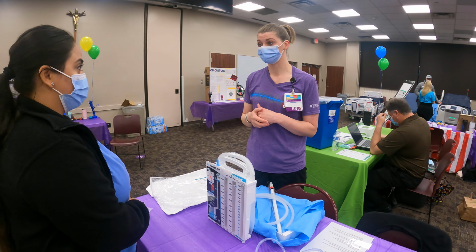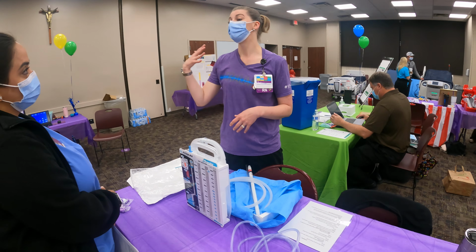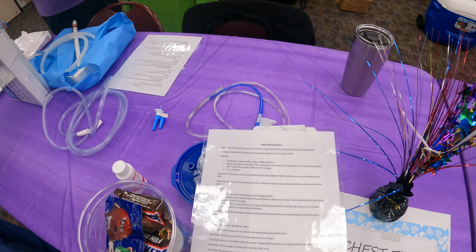It's 48 to 72. Yep. So you want to write your initials, your date and your time. You want to educate your patient. This needs to stay in for at least 48 to 72 hours.